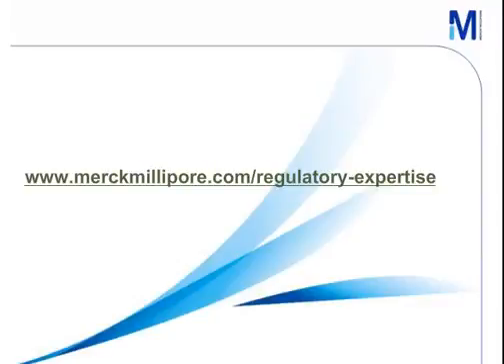Okay, thank you. The next question is a very practical one. How can I recognize that the media I have purchased are in accordance with the new ISO standard? Yeah, the first is that the quality control specifications given by the supplier certificate have to meet the specifications of the new ISO 11133 from this year. This can be checked easily, also if it is mentioned on the certificate itself.